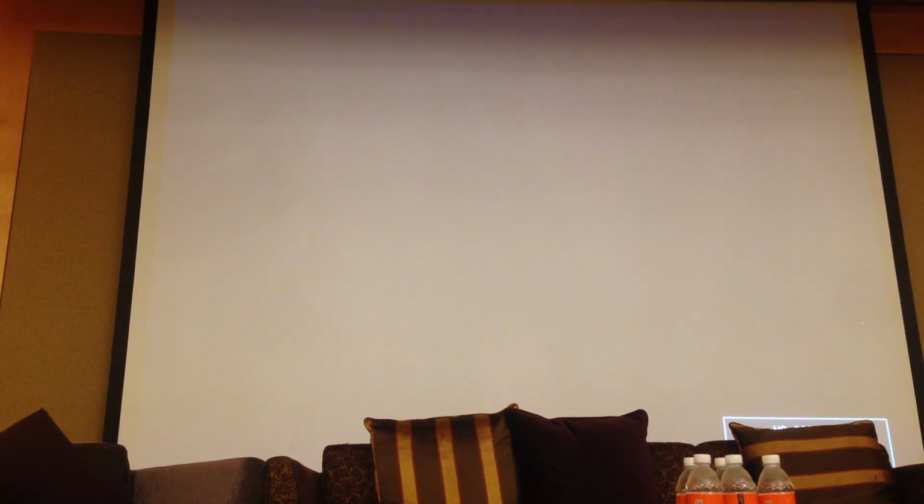Some of them already have given us ideas on how we can apply these to conditions that we see in the clinic. Others, we know that we see something perhaps different, something new, but we still need to learn how to apply this knowledge and how it can be useful. But that's the exciting part, and eventually, together, we will learn this and continue to grow our knowledge. So please, everyone, continue to work on this and use this, and let's see what we learn over the next few years. Thank you.